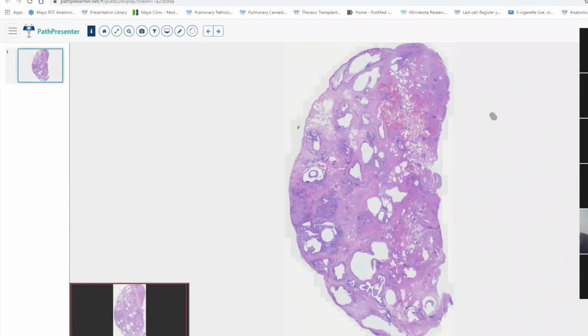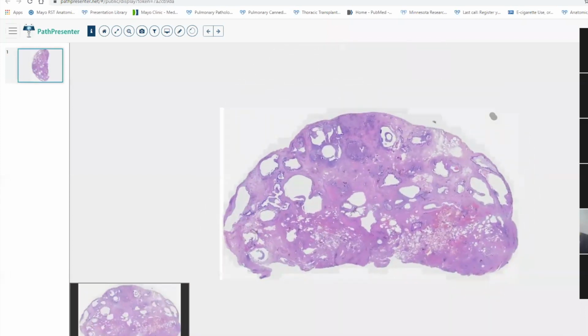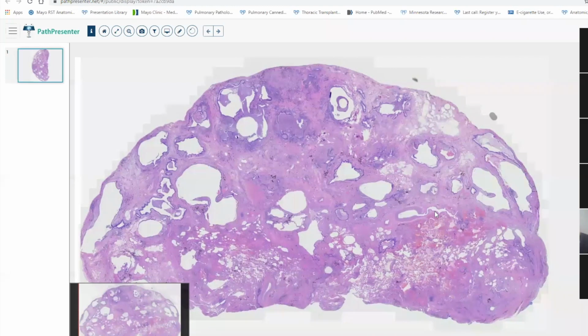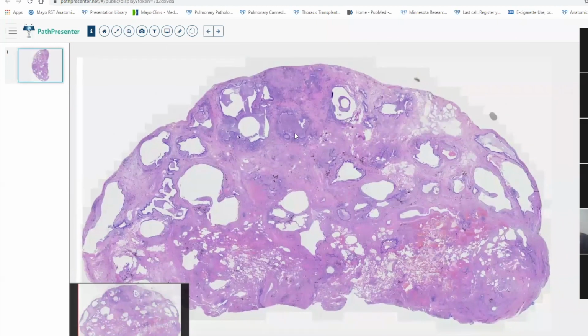Okay, so our next case here. So we have another surgical wedge biopsy, and we can see at low power that this is quite an abnormal specimen, where we have very little residual uninvolved lung. We have another point here from Sanjay. Thank you. So all fall under the umbrella of acute lung injury, so you get overlap. Thanks for that comment. So in this case, we have a relatively abnormal piece of lung, but we do have a bit of normal lung down here.